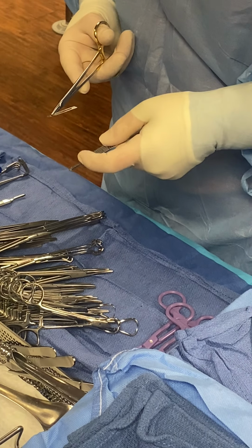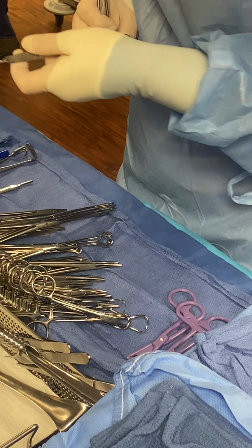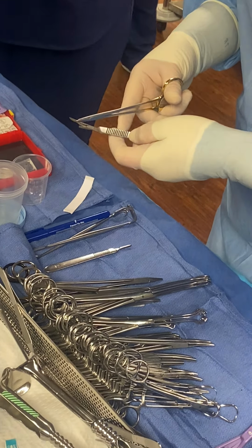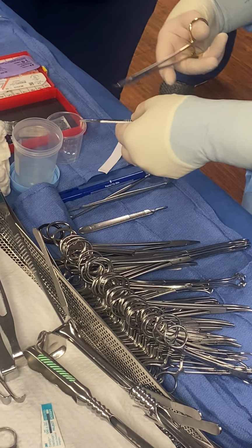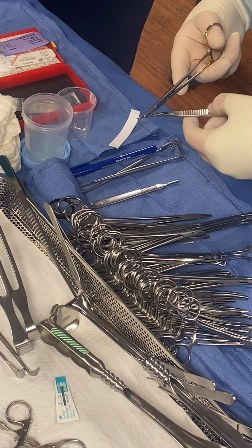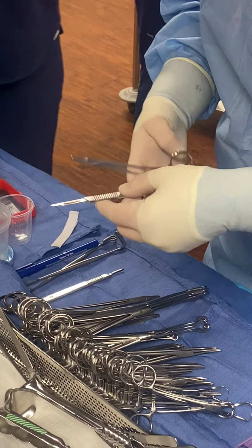This knife handle has the matching little key, if you will, and it has a little slot, a little groove on both sides. I don't know if you guys can see that. Another thing is this angle. The blade is angled in the same exact way, so that's how you know you have it oriented correctly. If it's like this, you can't see the key. So this is the way that it needs to be. Then you start it on through the keyhole and slide it till it locks on. Okay, and now it's ready to go.